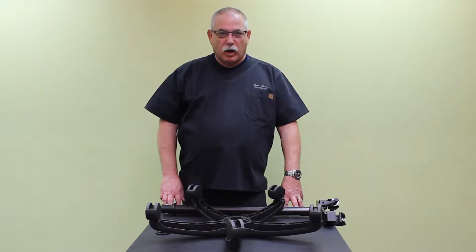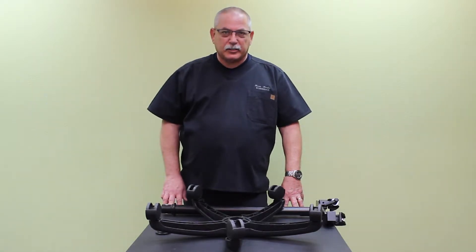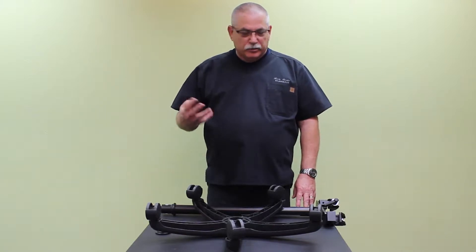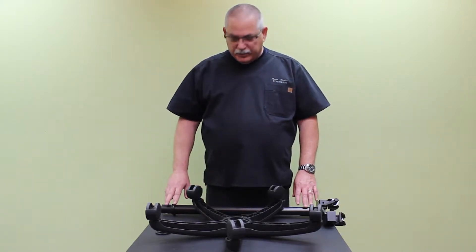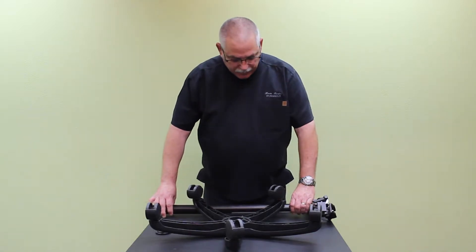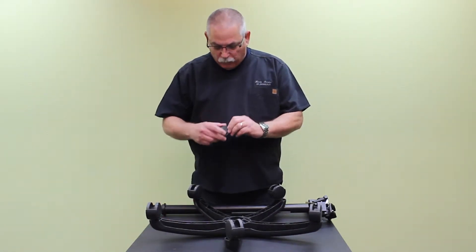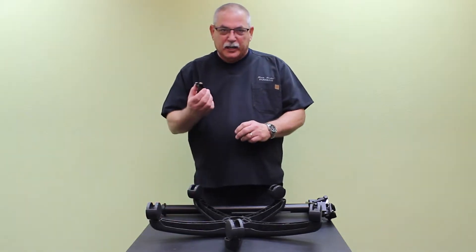The first thing we're going to want to do is assemble the transportation stand. As you unpacked, you should have four components to the transportation stand: the pole that has the threaded stud on the end, the rolling base, what we call a locating washer, and a locking knob.